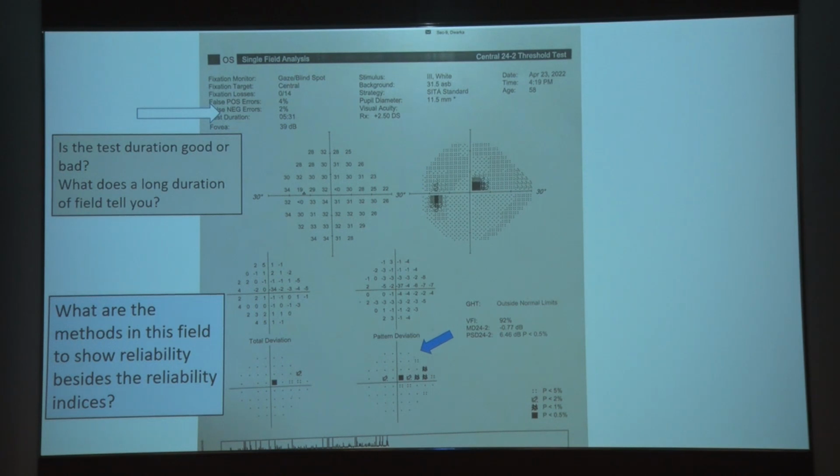Yes, so these are what happens here. Why do these spikes come? Where are they taken? They're taken on the cornea, right? On the center, so when the eye is moving, the image will be taken from the cornea only. This is actually a more sensitive indicator than those. Many times you will feel in clinical practice, all that looks normal, but the field is not normal, and the patient doesn't have anything to prove. So don't look there only, look here as well, right?